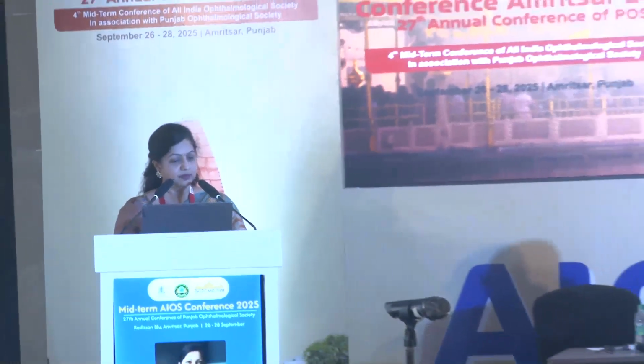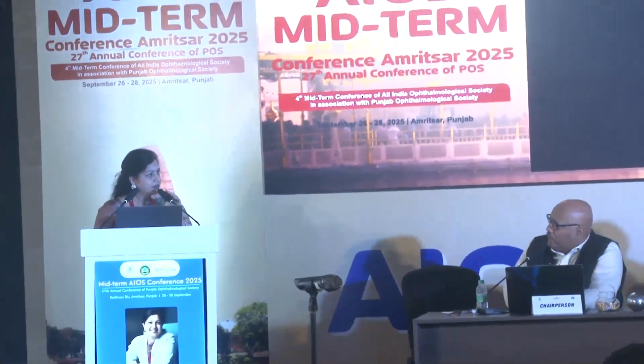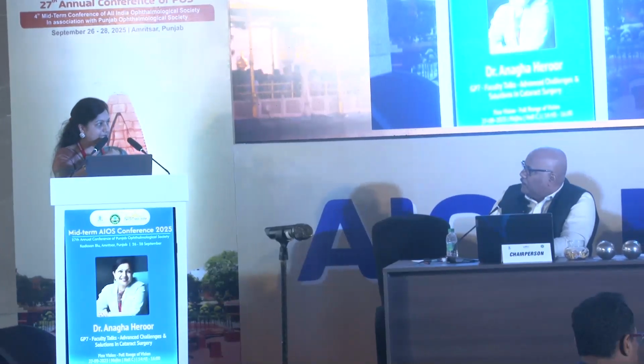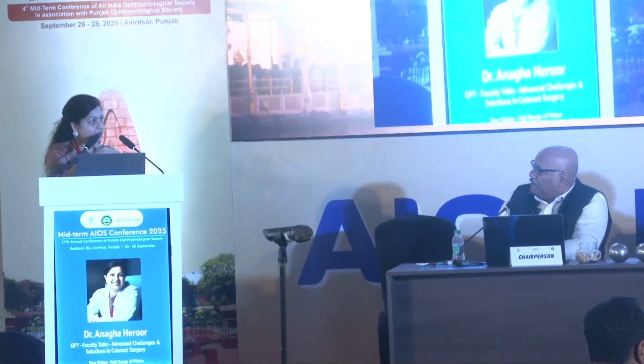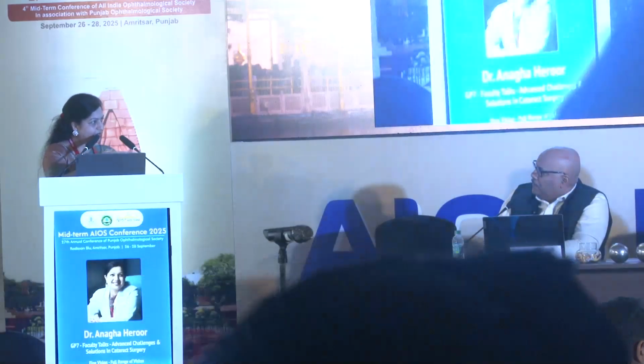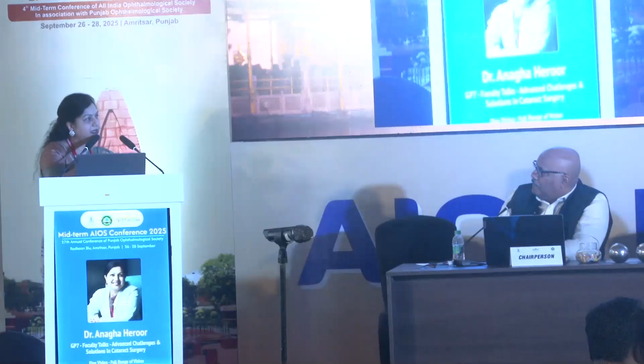Wonderful talk, Dr. Anagha. The few things I want to ask you is, how is the PCO effect with this kind of lens design? So as I mentioned, the PCO effect is really very less because of multiple reasons. One is the material. Secondly, it has a sandwich kind of technology, so it has a higher adhesiveness to the posterior capsule. It has a square edge and a posterior angulation, so it actually has a very, very minimal PCO rate, and a hydrophobic material.